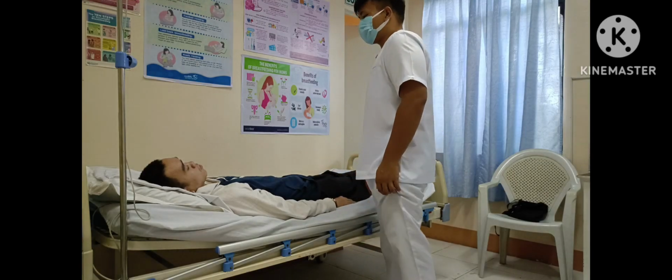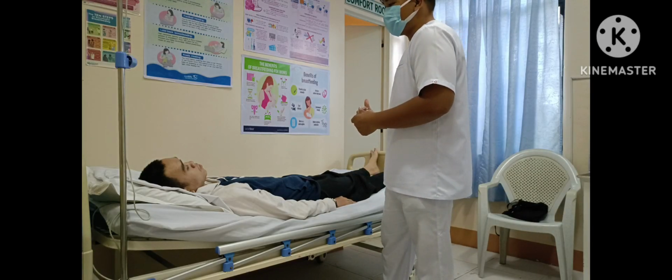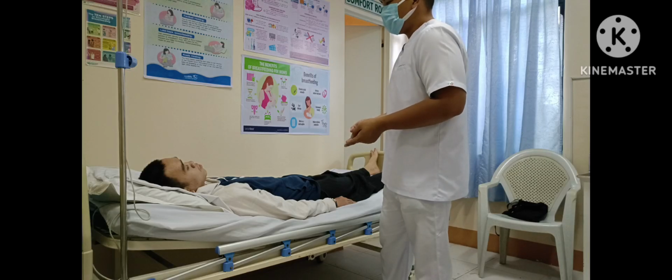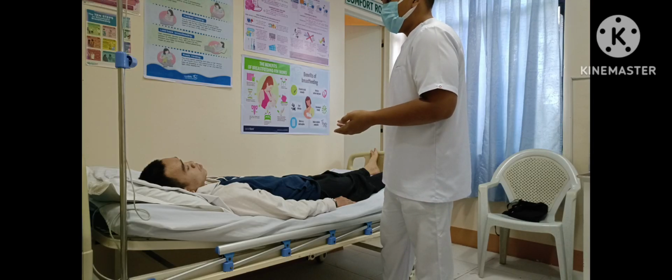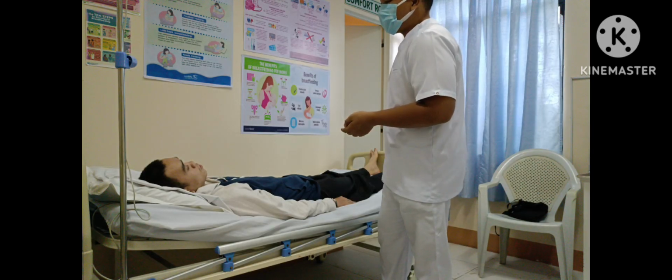Okay, Mr. De La Peña, so today the doctor is going to perform a lumbar puncture on you, and I'm just going to assist him. I'm just going to instruct you on what you're going to do. The purpose of the lumbar puncture is to determine if you have syphilis, meningitis, cancer, or any neurologic conditions that are likely to affect you. We're just going to insert a needle here on your spine or your lumbar area.